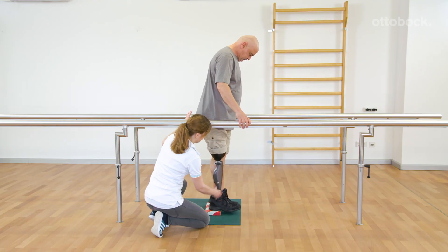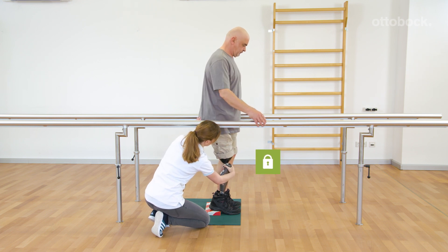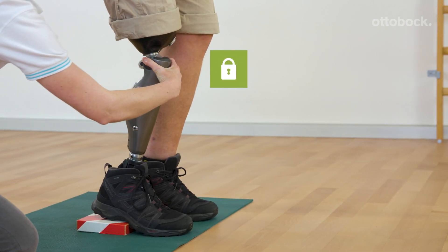Alternatively, it is possible to start with a yielding step. If the knee joint rotates forward by moving the center of mass forward, the stance function is deactivated. The knee bends against the stance flexion resistance.